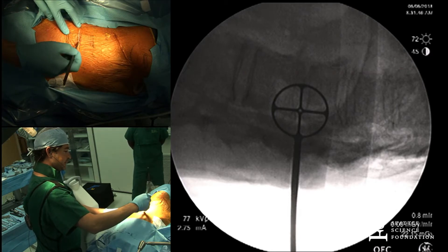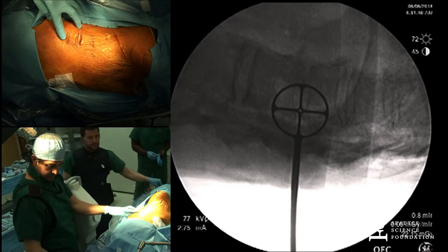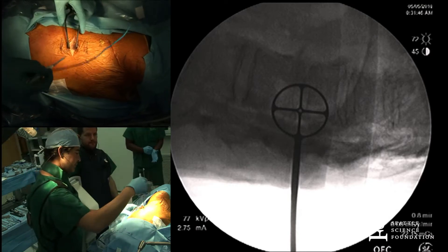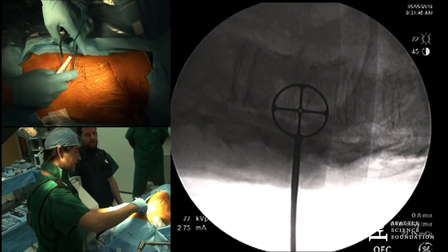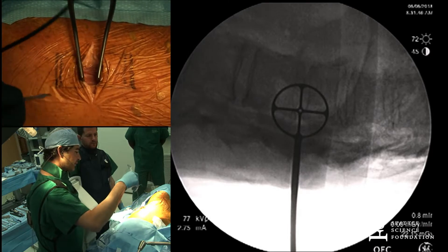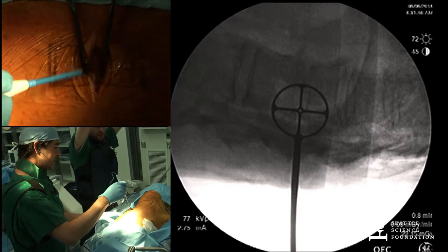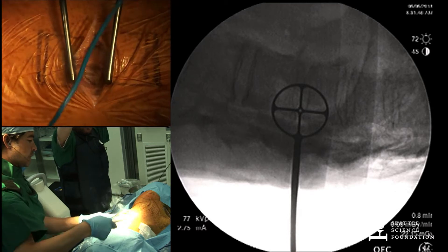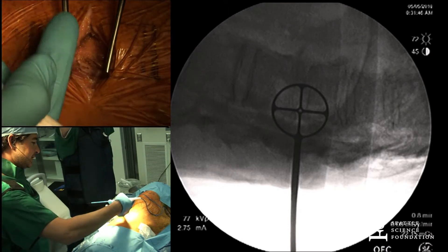We're just making a lateral incision, and we're going to go through the muscles and get right down on the rib. How do you make your incision — right along the rib space, parallel, or straight across? I used to try to make it right over the rib and follow the rib down. Now, whatever rib it is — you can see there's a rib coming across right here — we go ahead and take that rib out and follow it anteriorly.